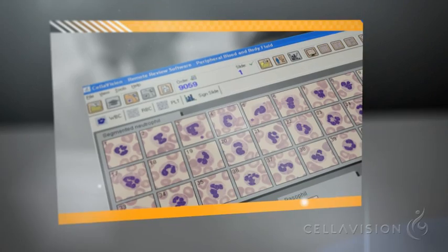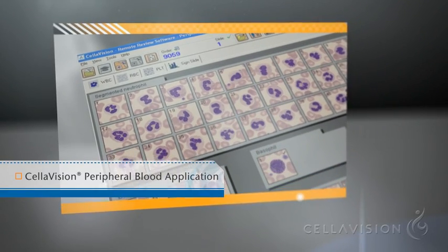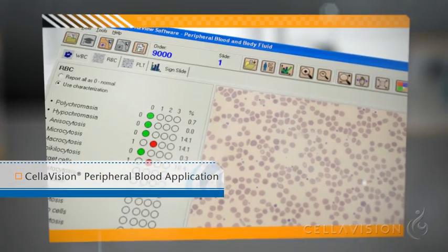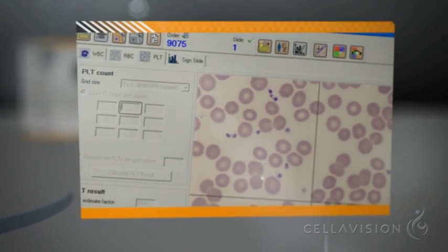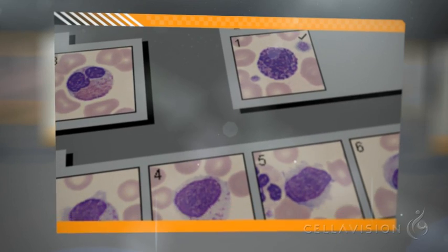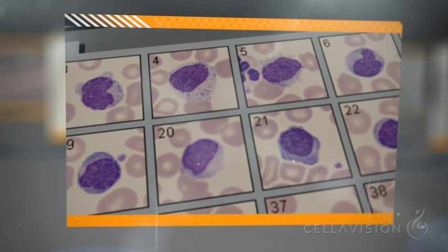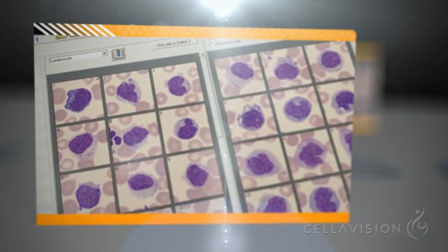The Cellavision peripheral blood application performs a preliminary WBC differential and RBC characterization, and provides functionality for platelet estimation. 100 WBCs can be displayed on a single screen for quick confirmation of the CBC analyzer result. Cells can also easily be displayed side by side for comparison.